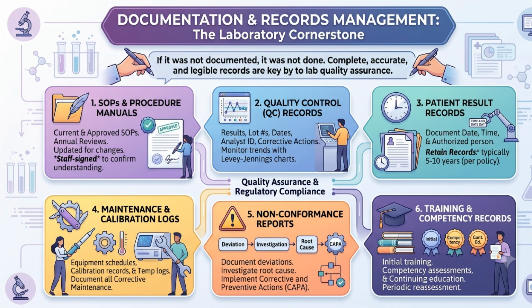Documentation is very important in the laboratory. A common saying is, if it is not documented, it was not done. Records include QC results, equipment maintenance, reagent logs, SOPs, incident reports, training records, and corrective actions. Documentation helps the laboratory trace problems and prove that procedures were performed correctly. It is also important for audit and accreditation.